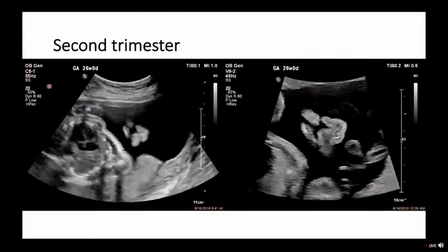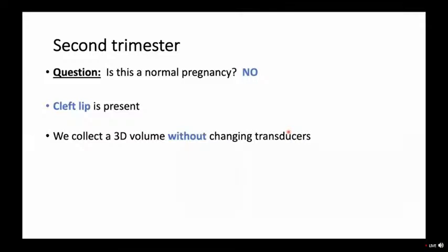C51 transducer, definitely you can see the unilateral defect. Higher frequency V92, there's a defect here as well. A little bit more crisp image, blacker blacks, whiter whites, a little greater contrast with the V92. We've started to use the V92 kind of as a primary transducer because it scans quite nicely. And then the cool thing is, when you have something like this, maybe you grab a quick 3D without having to switch transducers. So there's definitely a unilateral cleft lip.